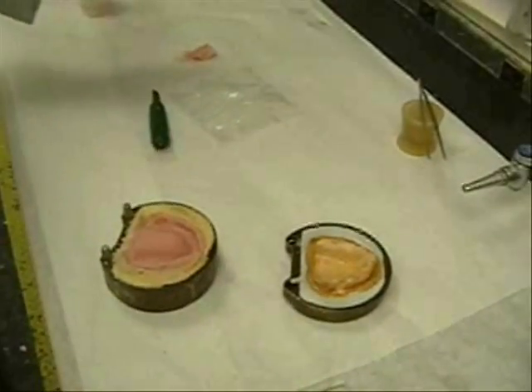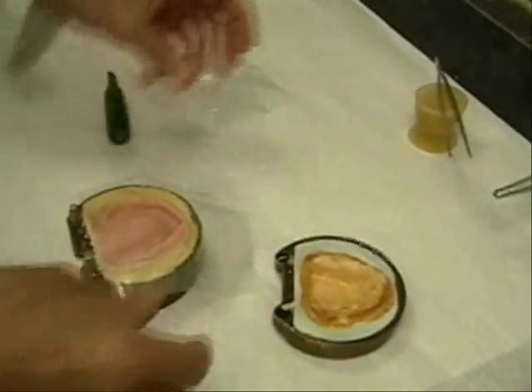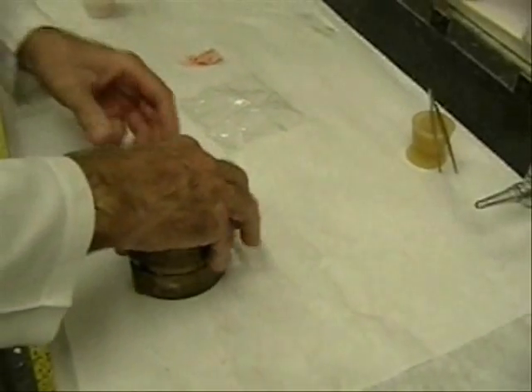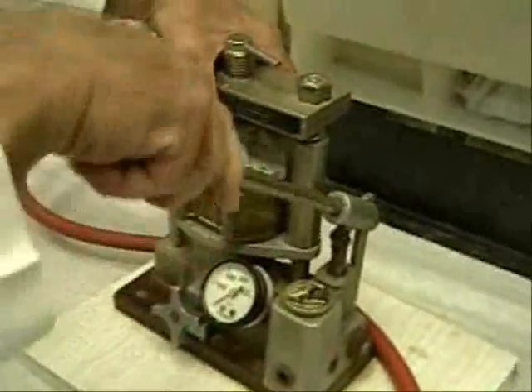With the excess acrylic resin removed, the flask is again closed. And now the pressure is increased to 1,500 psi.